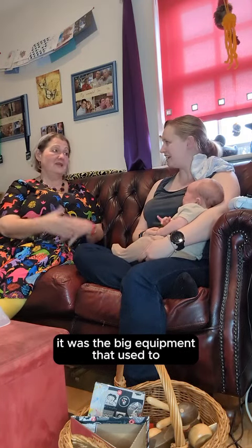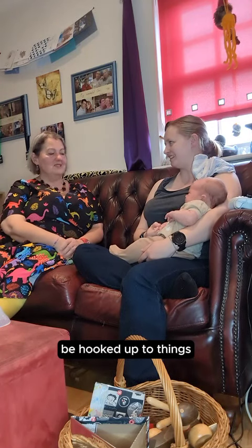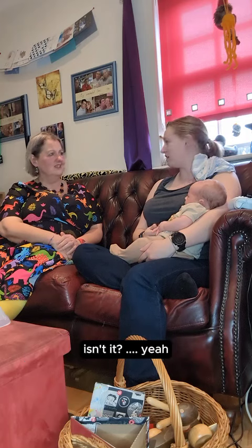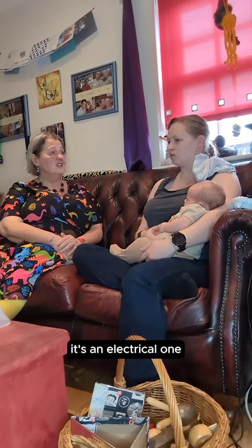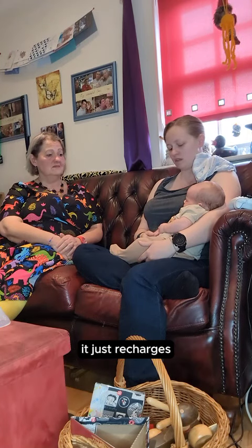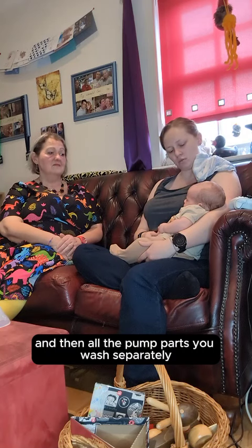Because back in my day, it's big equipment that used to sort of be hooked up to things, but it's so hands-free now a lot of the time, isn't it? Yeah, so my breast pump's actually on this side, it's an electrical one, it's hands-free, so I don't really have to worry about it. It just recharges, and then all the pump parts you wash separately.